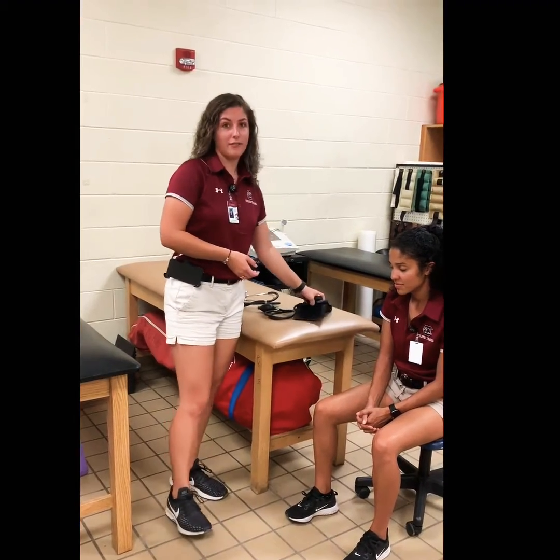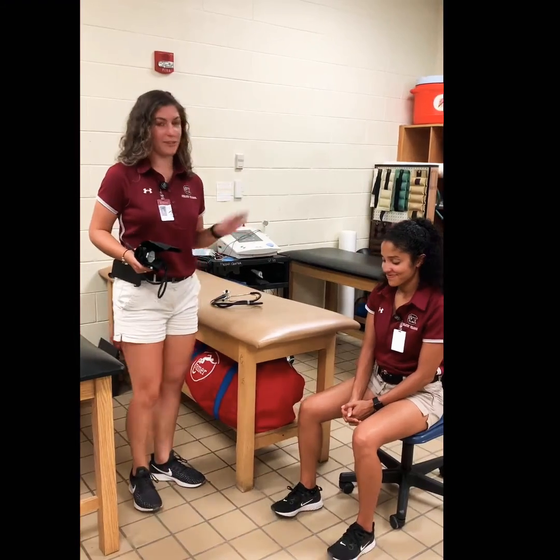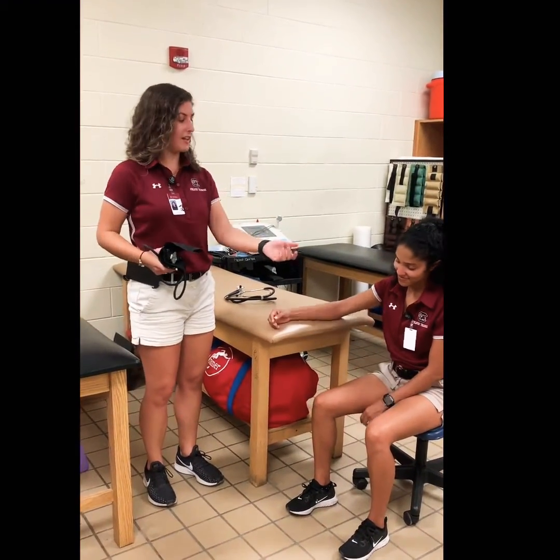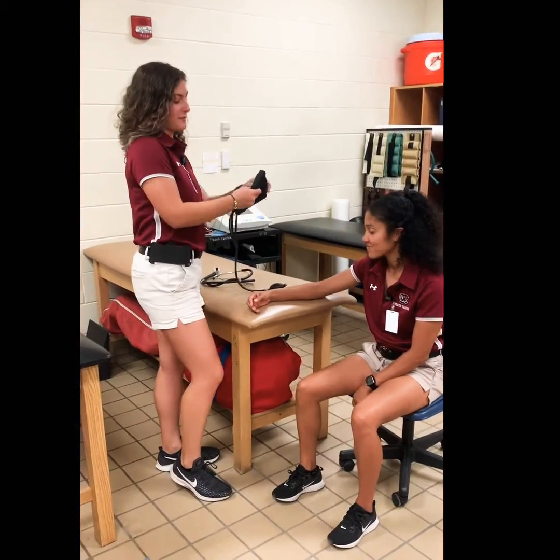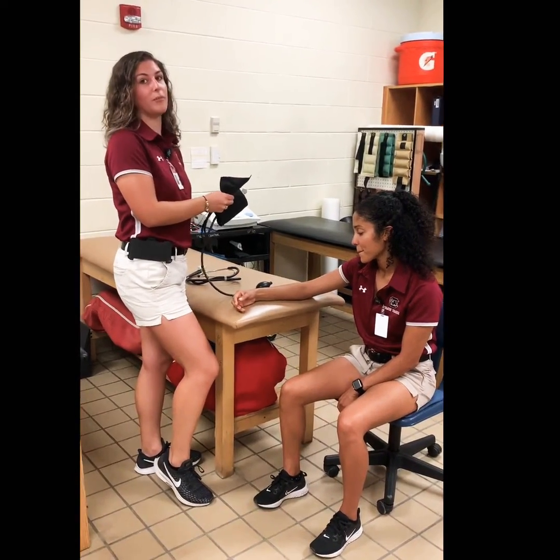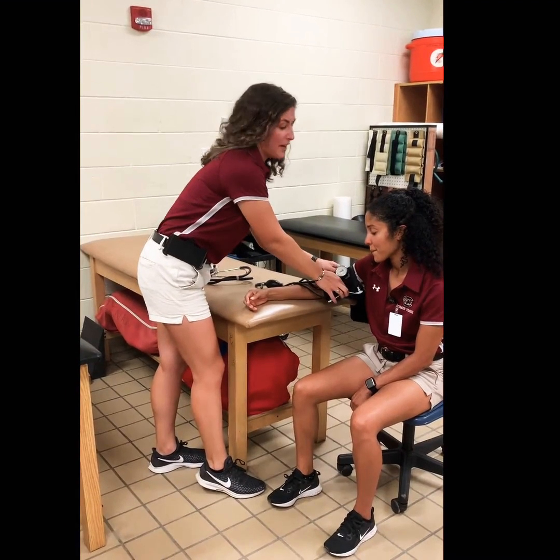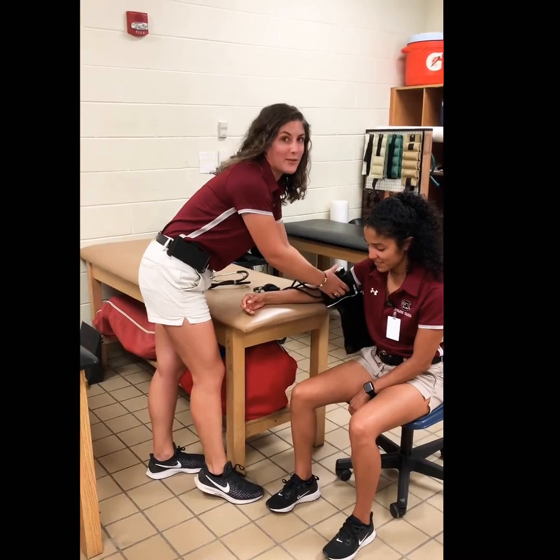You need a blood pressure cuff and a patient. You're going to ask your patient to sit up straight with their feet flat on the floor and their arm rested and elevated at about heart level. Take your blood pressure cuff, make sure you find the artery marking, and line that up with the brachial artery. Make sure you're using the right size cuff for the patient — there is a pediatric cuff and an extra large cuff that is also sold.